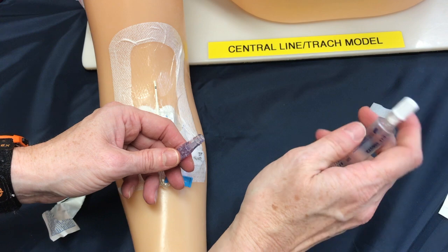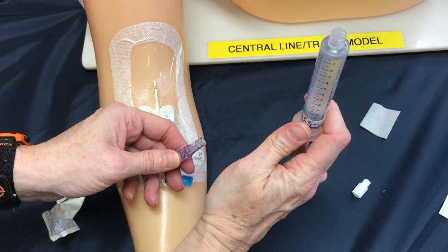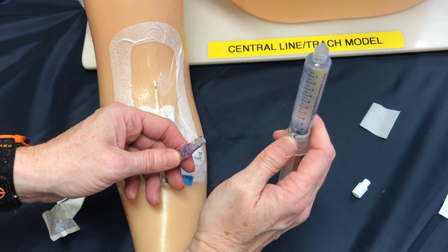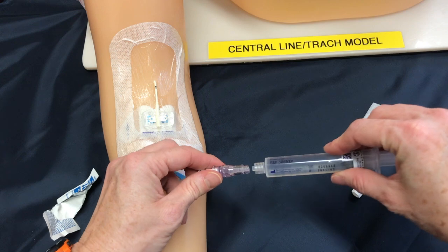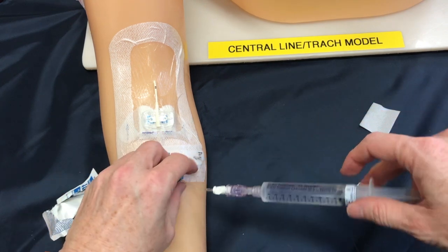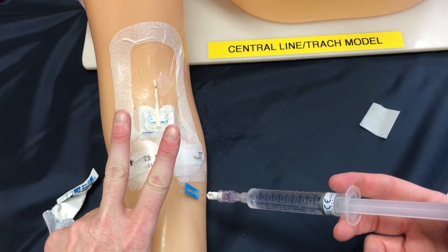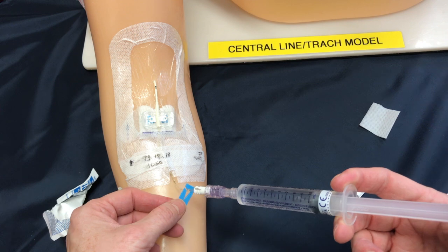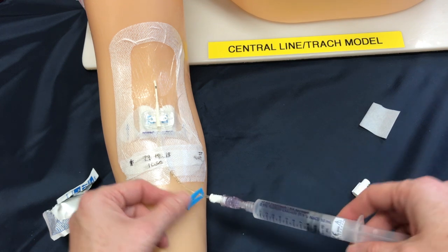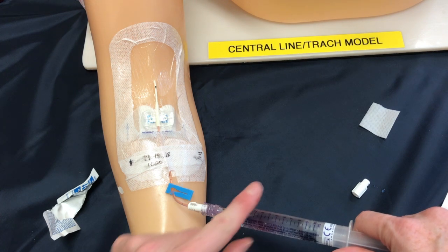Getting my saline ready, I'm going to prepare my syringe by removing the air and then attach with a push and twisting motion. Now we want to unlock the line so that we can infuse our saline. We're first going to put in two mils of saline with a gentle pressure. After those two mils are in we're actually going to pull back now and look for a flash of blood in our saline — this is telling us that the line is patent, and there we have it.